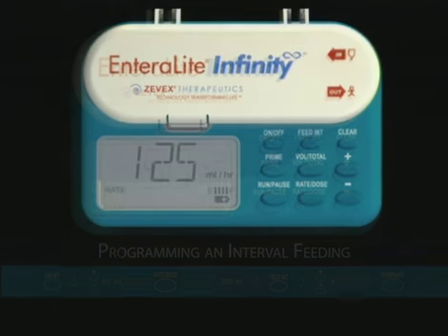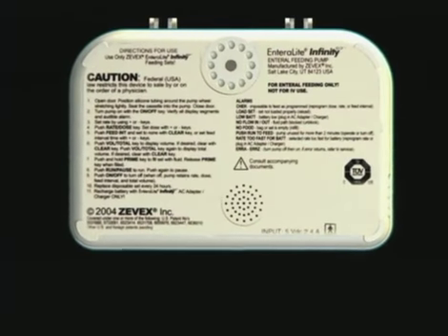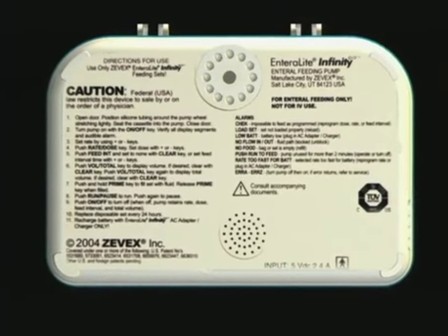For a reminder of how to prime, set, and run the EnteraLite Infinity, the label on the back of the pump has simplified instructions as well as a list of the alarms and their solutions.